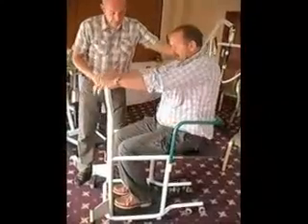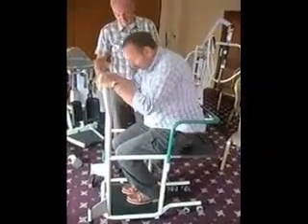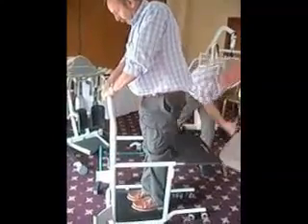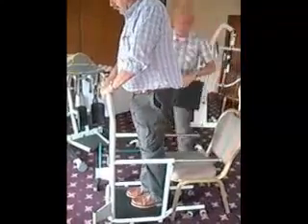Come on, stand up. So you ask somebody to come to the front, the legs to the back, and in a natural position you go up, bring the pieces off, and take the board to the back.